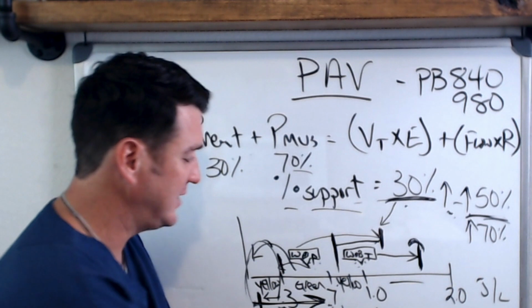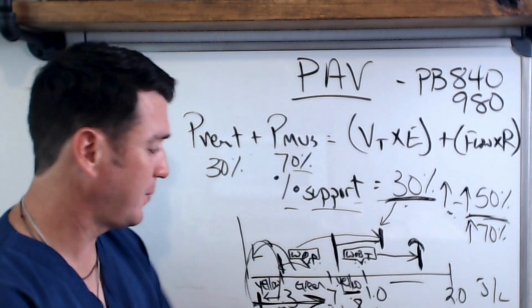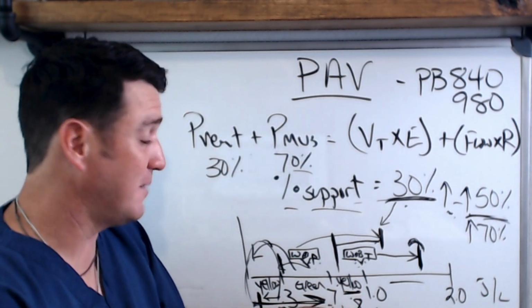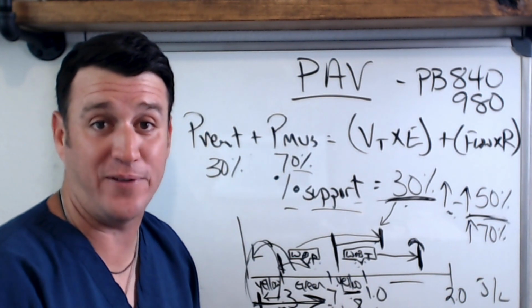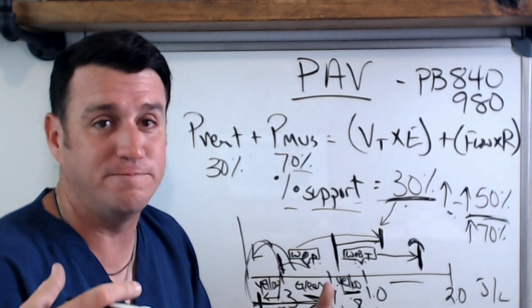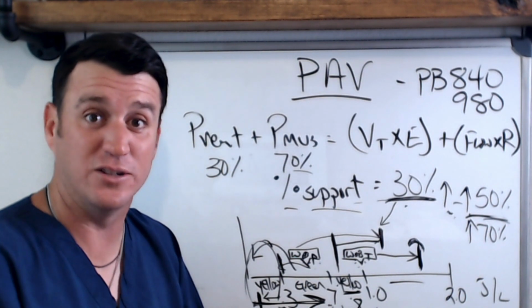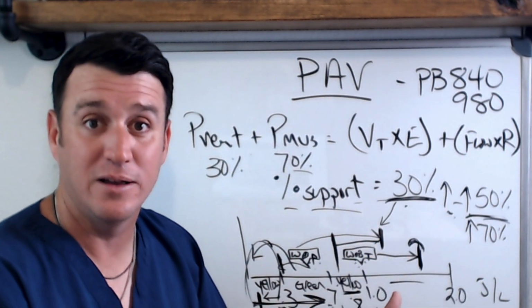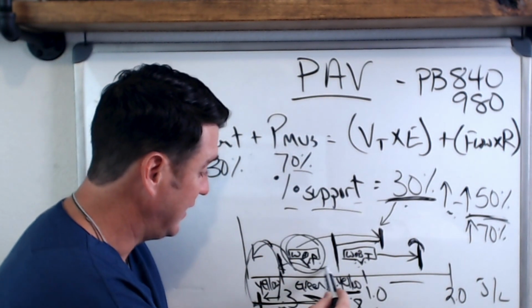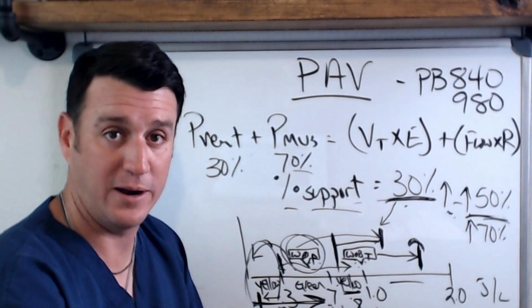I'm not saying you won't ever extubate somebody at the 0.8. 0.8 is in this yellow range here, 100%. I've seen people extubated from there before, but that would be like somebody in a pressure support of 5, CPAP of 5 with a pressure support of 5, and having an RSBI of like 95 or 102. And you go, oh, they're borderline. They look like they're going to do well. Let's give them a shot, right? So understand that the more the patient's work of breathing tab is greater than 0.7, the more work they are doing. All right.